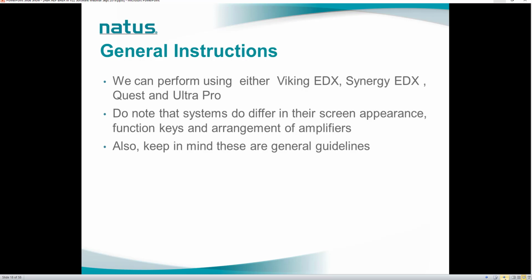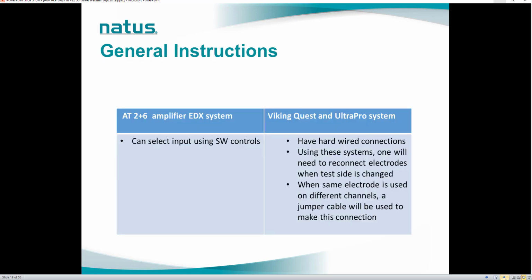So just some general instruction. For our system, we can perform ABR tests using either Viking EDX, Synergy EDX, Viking Quest, and also Ultra Pro. So just do note that systems do differ in their screen appearance, function key, and arrangement of amplifiers. And just to remind, these are general guidelines.